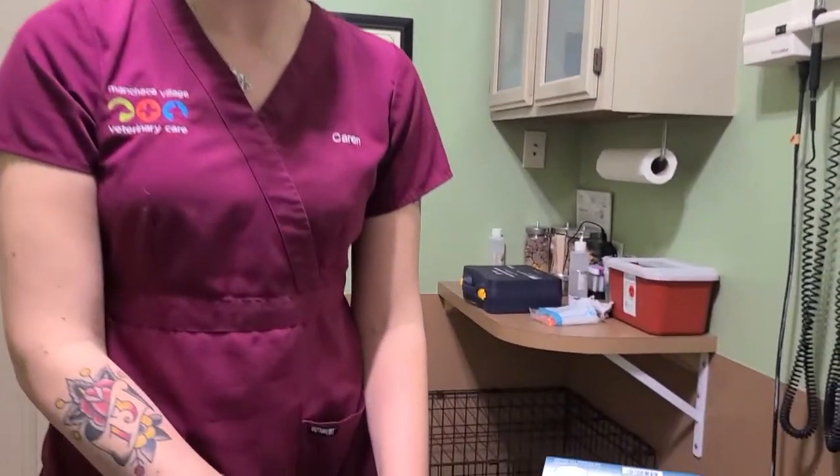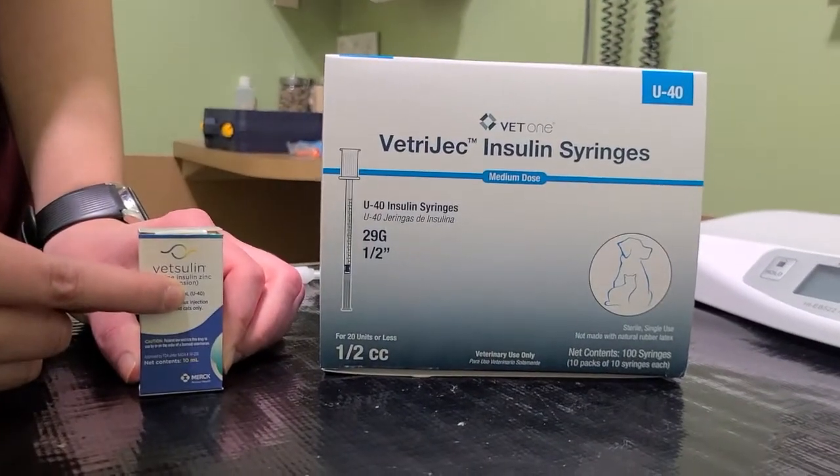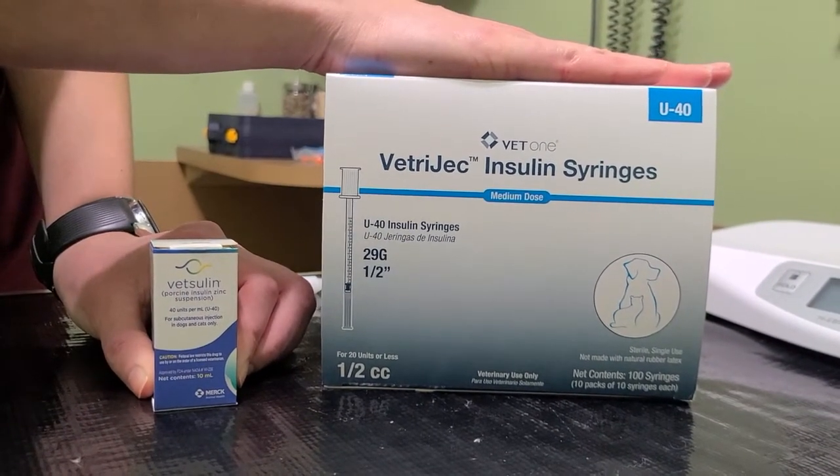Now going back to our syringes — this one, specifically Vetsulin, requires U40 syringes. It will tell you on the box. This one specifically needs this type of syringe for the proper units for your pet.